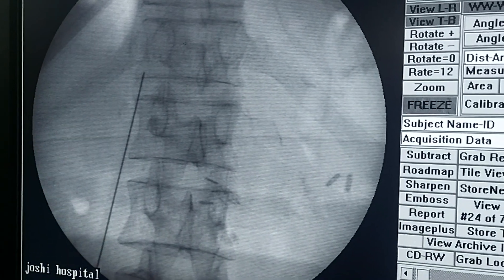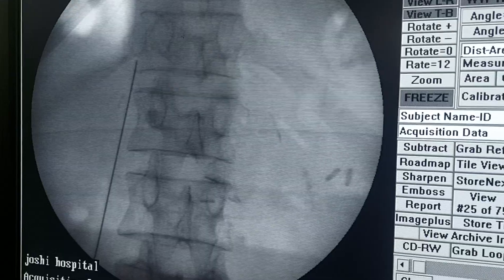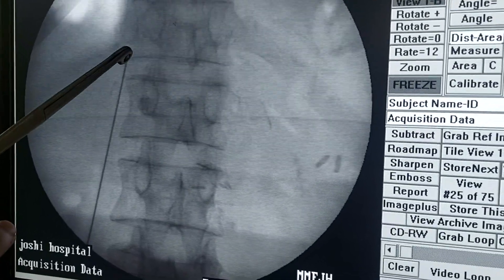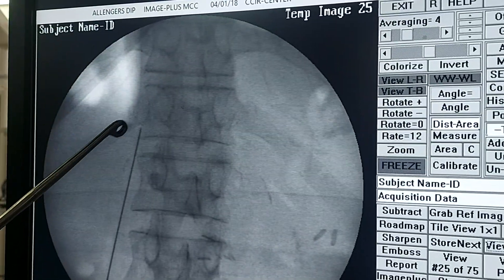We'll start the needle entry. We'll enter in between the rib, the lateral part of the vertebral body, and medial to the pleura. You can see the nice pleural line over here.